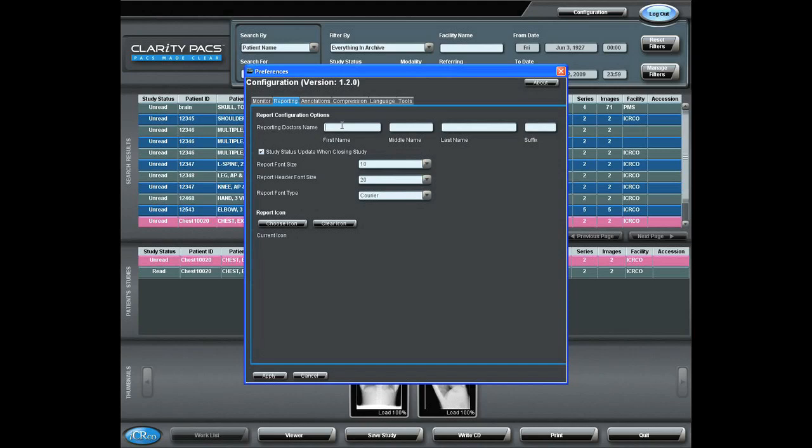So, let me indicate the user's first name. For this one, I'll use Dr. John T. Doe.